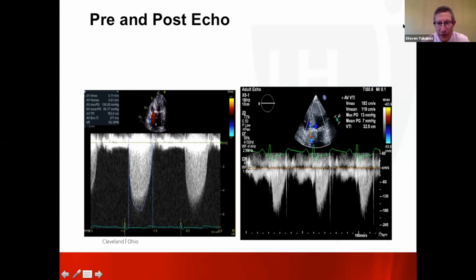Guy, do you have any information about that? No, not really, Steve. I think it's a very important question, right? In terms of, again, the fact that the valve is supraannular, right? We would expect that there is a circularity in the coaptation level of the leaflets, and it's not as much affected by that elliptical shape down in the commissure.